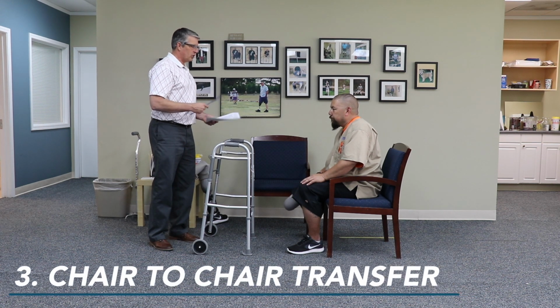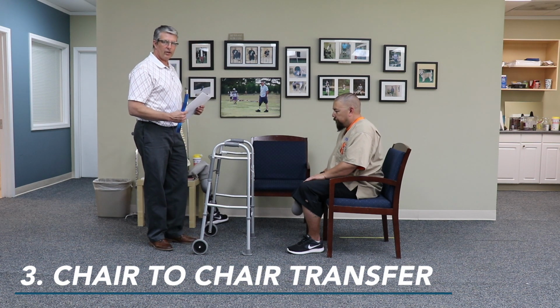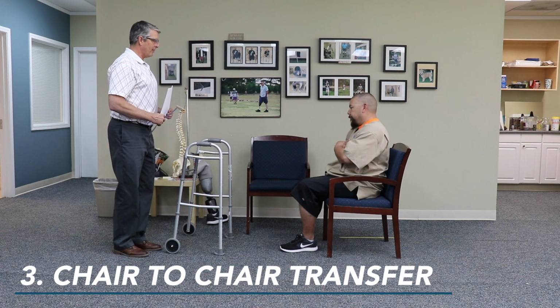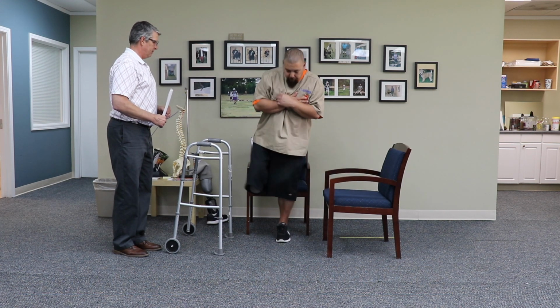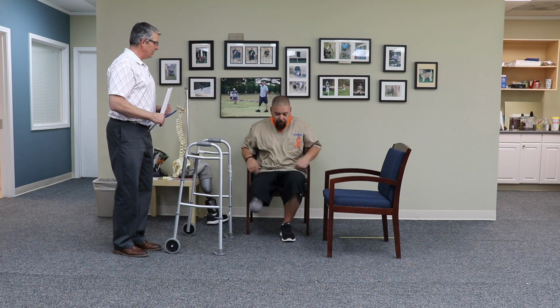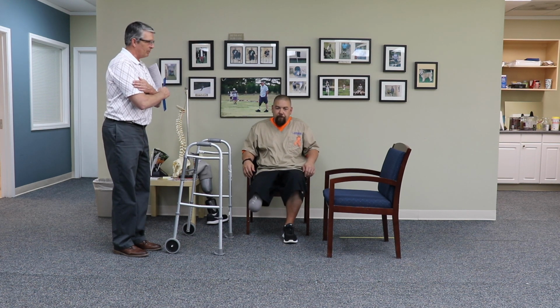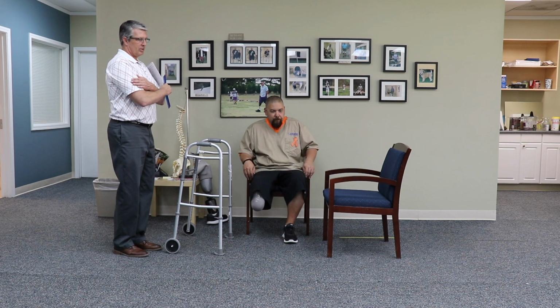So now we're going to do the chair-to-chair transfer. Okay, that's number 3 on the list. And you're going to have your patient transfer from one to the other. Okay, that was a very successful transfer. Arms are crossed. I was able to get up independently and controlled. Still transferred to the other chair even without his prosthesis.